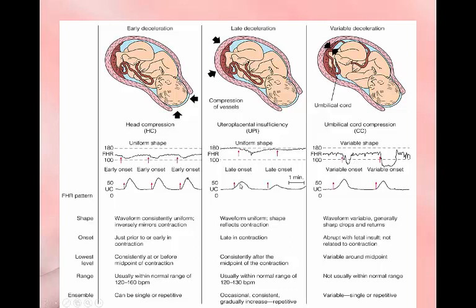The way you know it's a late, you find the peak of the contraction, okay, take your finger up on the tracing. The deceleration starts after the peak of the contraction. Okay, so here's your peak, here's where the deceleration is starting. So they are late in onset. Okay.